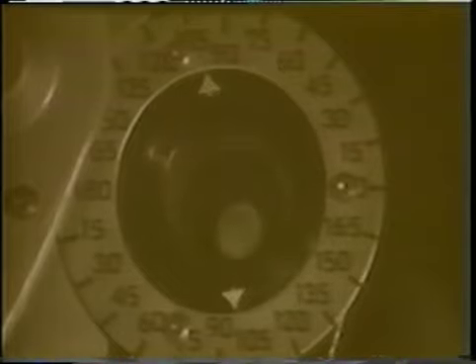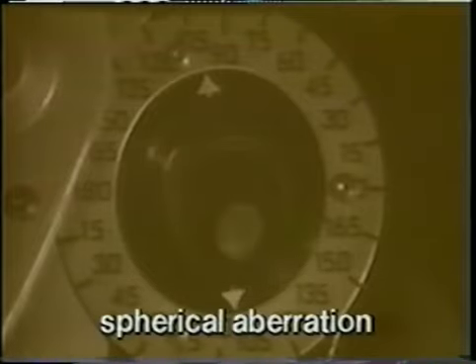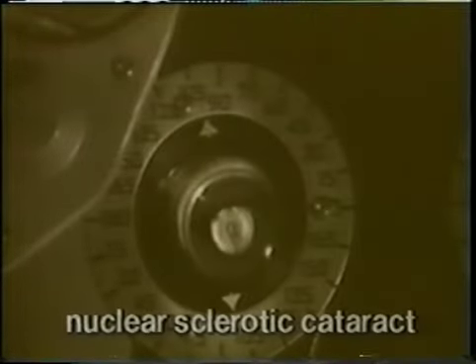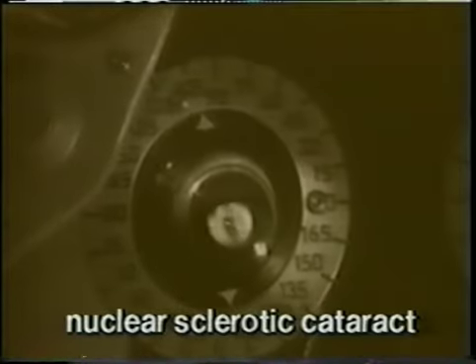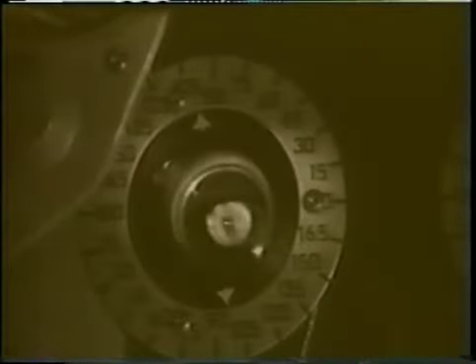In this young child with a dilated pupil, the central portion of the reflex has with movement, but the peripheral portion has against movement. This is spherical aberration, common in young eyes. This is easy enough to deal with. We simply neutralize the center of the reflex and ignore the myopic periphery. Spherical aberration is also present with nuclear sclerotic cataracts, but here the center portion of the pupil is myopic. The central reflex shows against movement, and the periphery shows with movement.